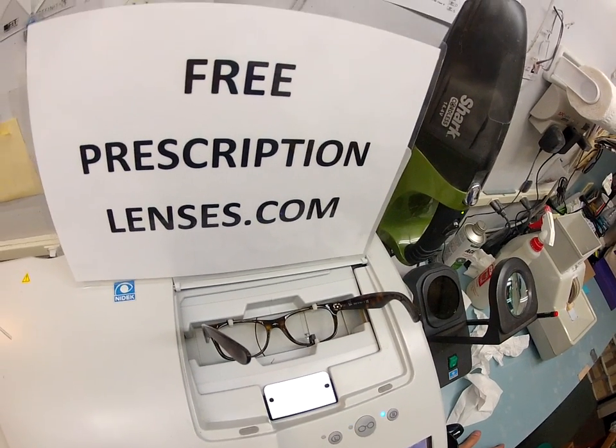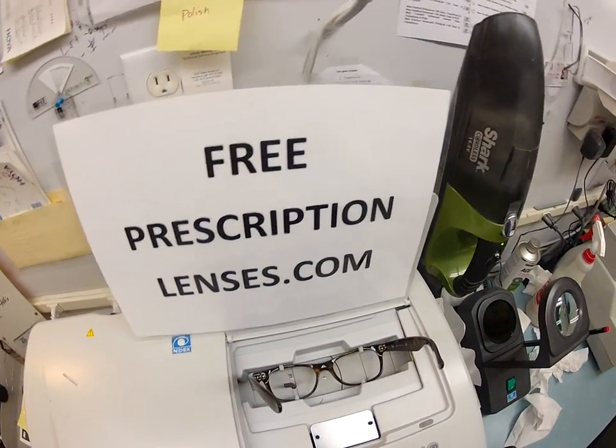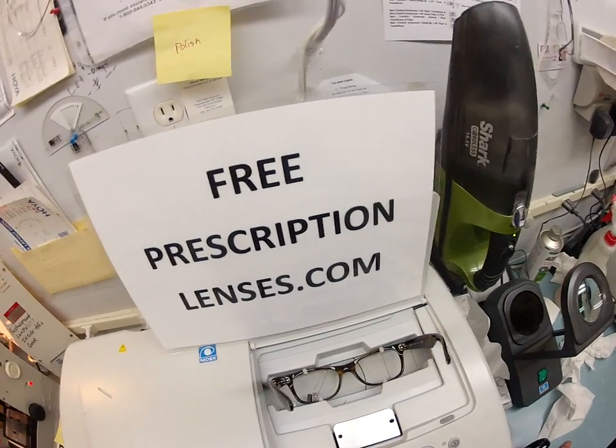You buy the frame and you get free prescription lenses in them. 99% of all prescriptions are free. If you have a really high, strong prescription, you just pay my cost and that's it.